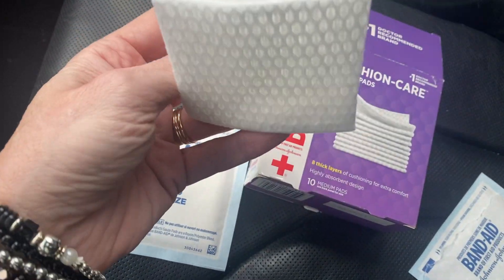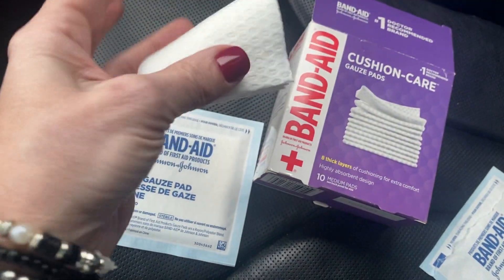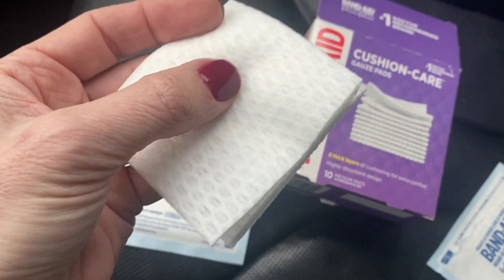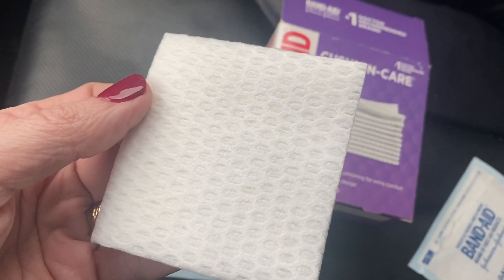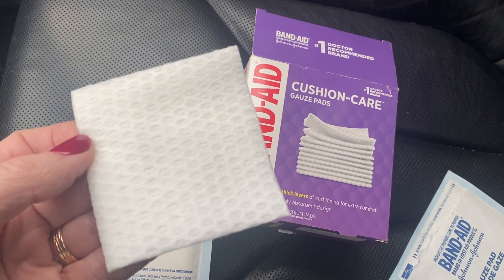If you need to thin it out, you could cut it. What I've done for the cut I'm working on is cut it across and make it more narrow, so I'm actually getting two out of one pad. I just put the other half right back in the packaging. Overall, we're really liking these Cushion Care gauze pads.